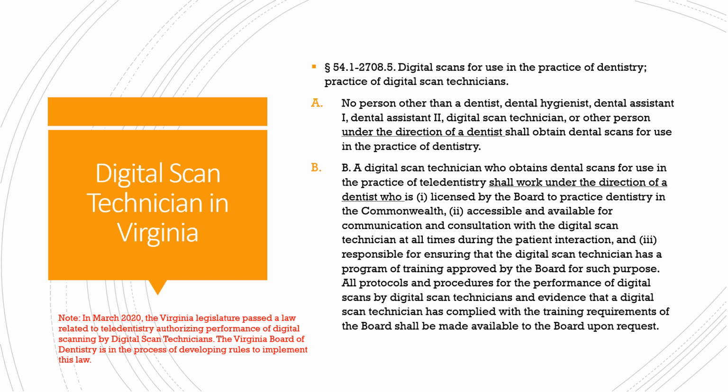Those state boards have not yet regulated the use of intraoral scanners. However, you want to make sure that you look at the state. So this here is what Virginia is saying. In March 2020, the Virginia legislature passed a law related to teledentistry, authorizing performance of digital scanning by digital scan technicians. If you go back to the vocabulary, I explained what a digital scan technician is. It needs to be someone who has had training that's approved by the board.